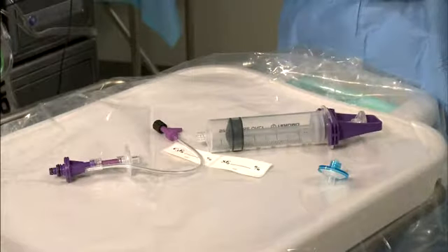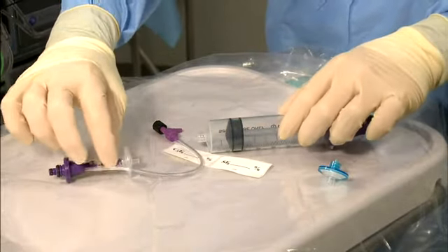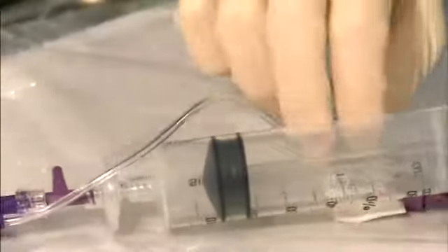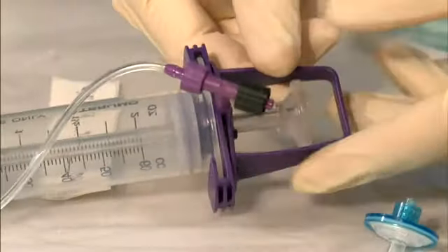Each pack contains one pneumatic connector assembly, one auto gas fill syringe assembly, plus an extra filter. Connect the filter on the purple pneumatic connector assembly to the auto gas fill syringe assembly. Connect the clear tubing found on the pneumatic connector assembly to the female luer port on the rear adapter of the auto gas fill syringe assembly.